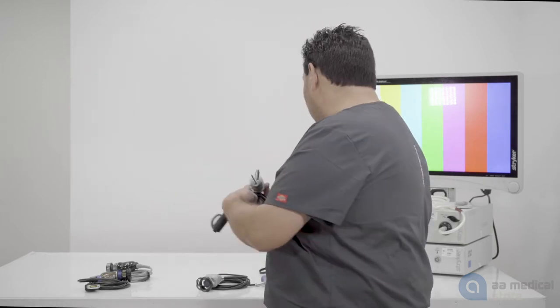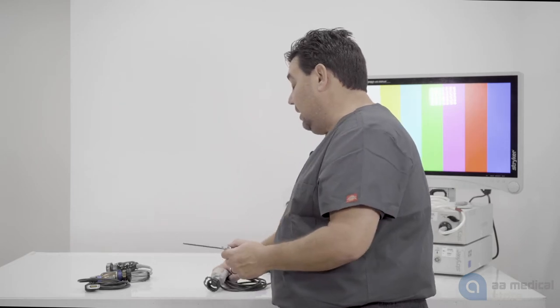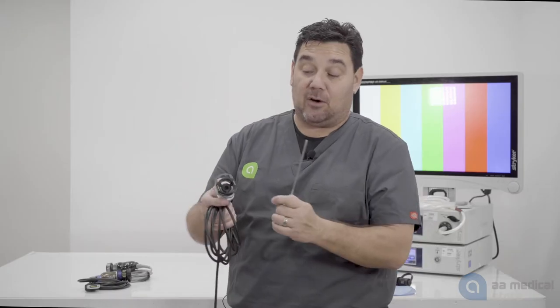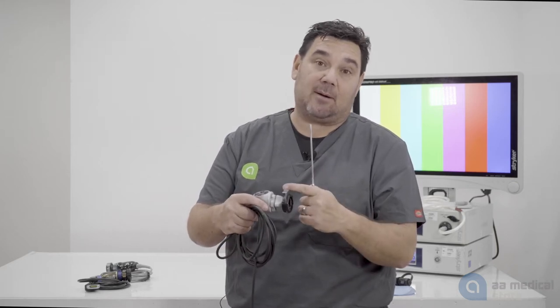The other example for video hookup or scopes is going to be an eyepiece arthroscope. It has an eyepiece, and then your camera itself is now replaced with an actual coupler that screws into the camera.